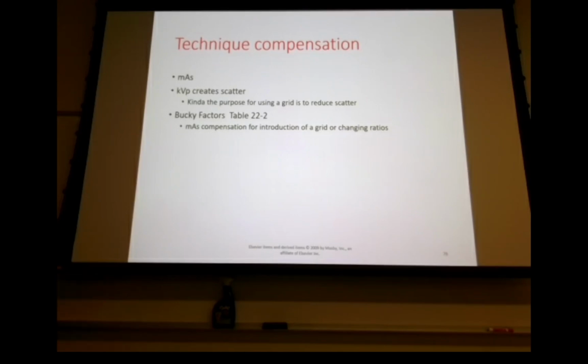You may have a word problem that says maybe you shot a chest x-ray, a decubitus chest x-ray, the patient had pleural effusion. Pleural effusion will really screw up an x-ray, create scatter radiation where we should not have scatter radiation. So we go to do a pleural effusion decubitus chest x-ray, you add a grid.